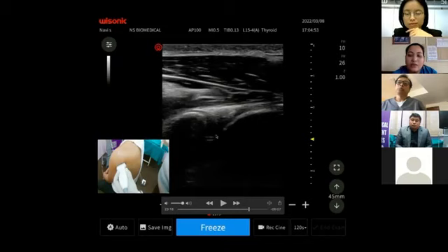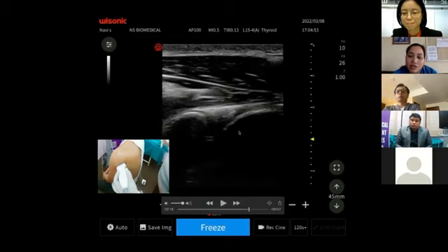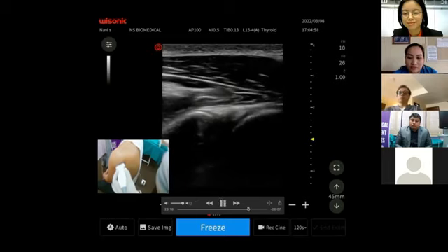This joint is very important from the perspective of pain management, because treatment of the posterior glenohumeral joint has been shown to provide better analgesia in case of adhesive capsulitis. It's not only static imaging. By dynamic imaging, we can see even minimal effusion in the posterior glenohumeral joint, by asking our patient to internally or externally rotate their hand, in which the head of the humerus will move and even a minimal amount of fluid can be seen at the posterior joint recess.